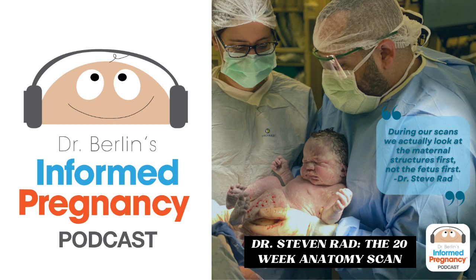So there's 2 vessels in the umbilical cord, 1 vein, 1 artery, so either a 2-vessel cord, or another name for it is a single umbilical artery. So there are 2 ways to look for that. The normal is a 3-vessel umbilical cord.